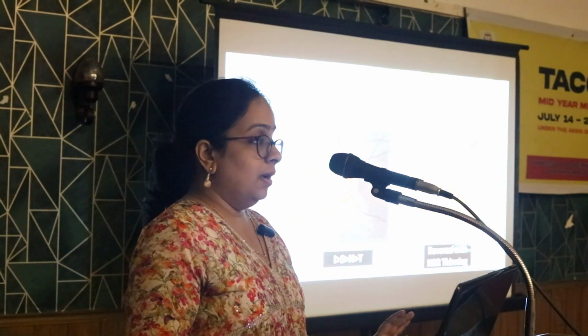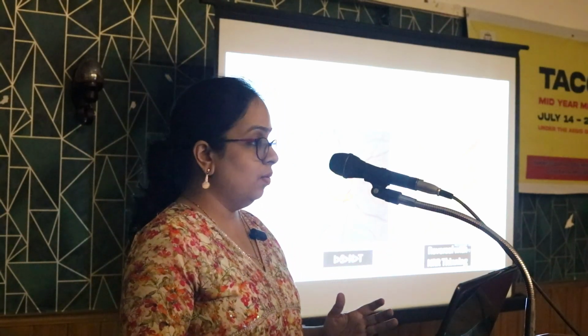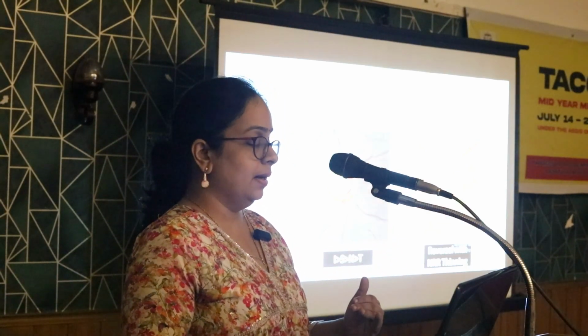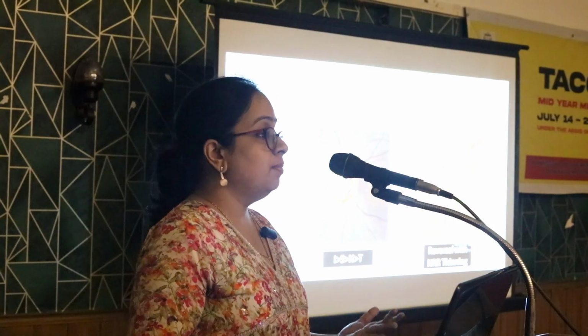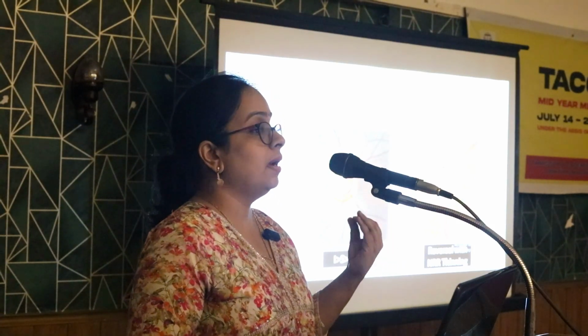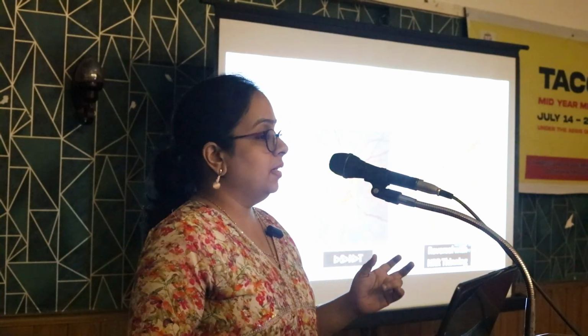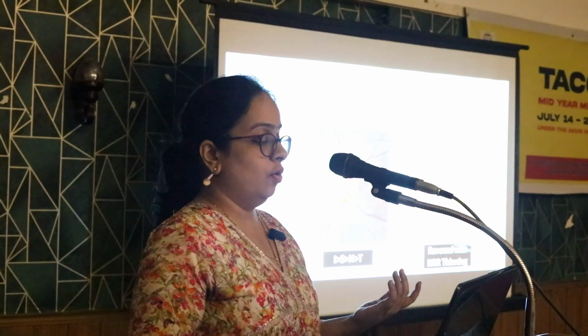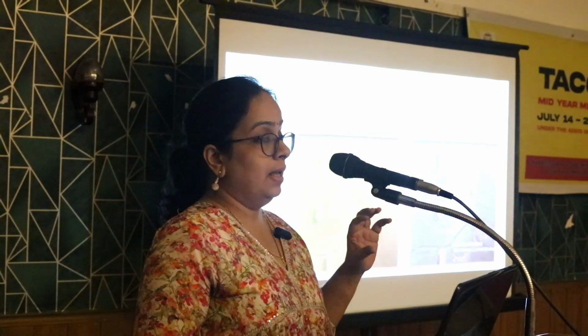Next is the neuroretinal rim, which is a little more specific. It usually obeys the ISNT rule: inferior is thicker than superior, then nasal and temporal. If there is a reversal, it means there is thinning at the superior or inferior pole, producing a notching, and that is a little more specific of glaucoma. And a more specific one is the retinal nerve fiber layer defect.